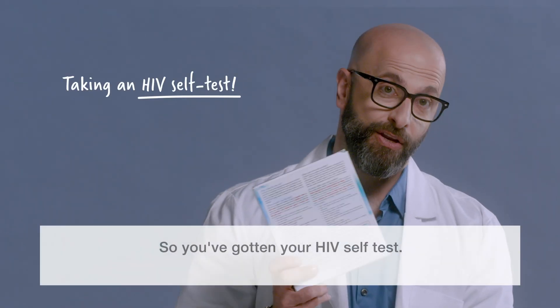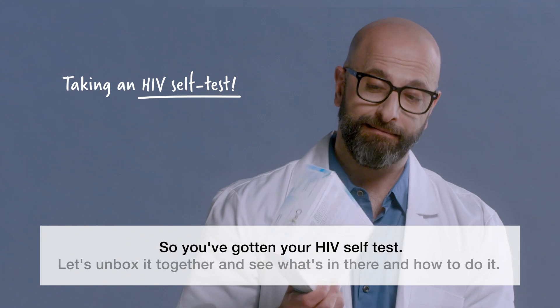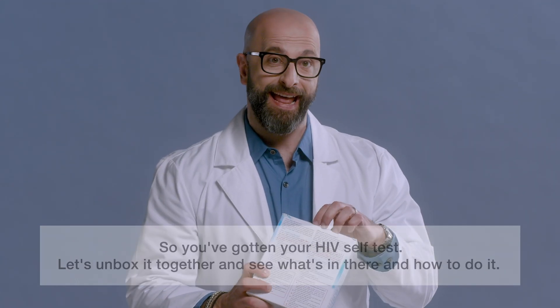I'm Dr. Dimitri and I'm your HIV doctor. So you've gotten your HIV self-test. Let's unbox it together and see what's in there and how to do it.